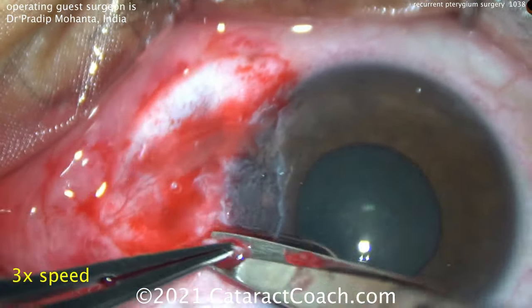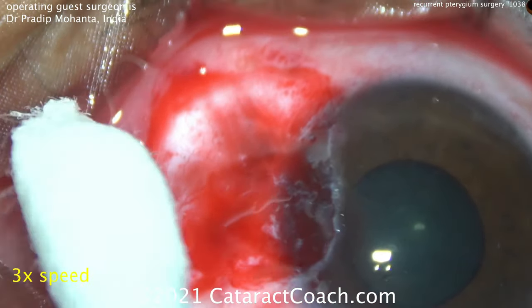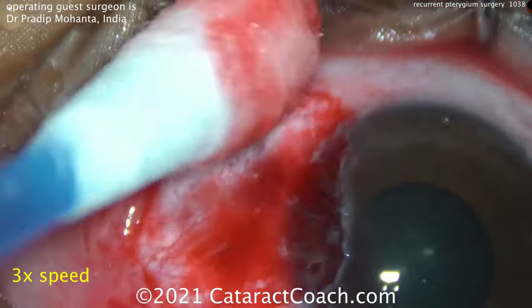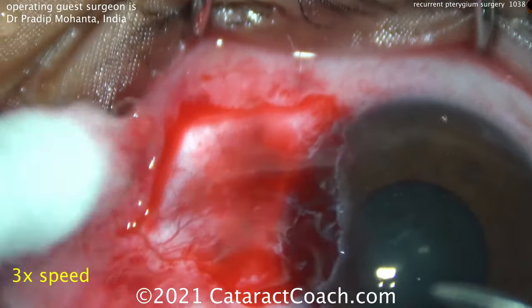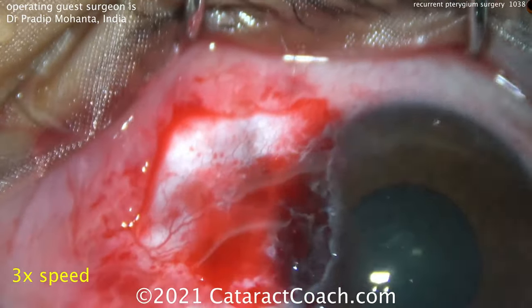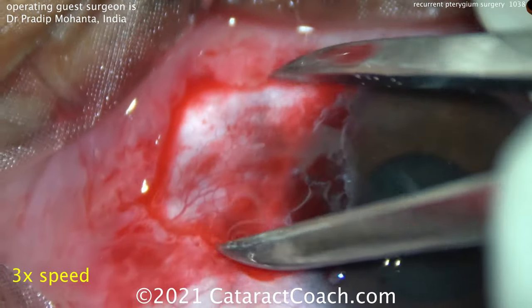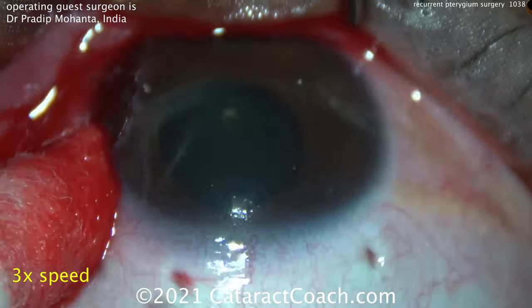Once the Tenon's is removed, there you see we have bare sclera. There are a couple of areas that are thinned out, and that may be from prior use of cautery — which you have to be very careful of on bare sclera — or maybe a mitomycin agent was used previously; you don't really know. Dabbing everything here, and now you see the extent of that conjunctival opening. He's using calipers to measure it. No cautery at all.